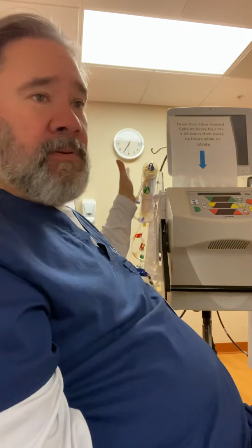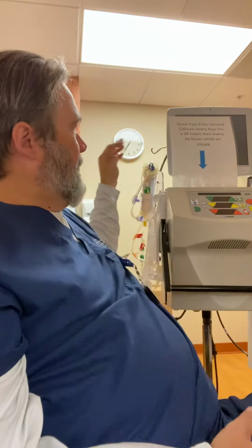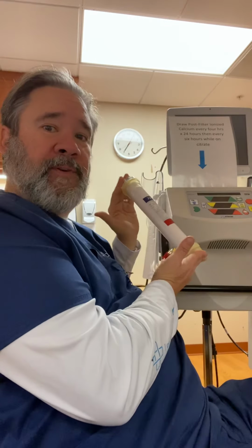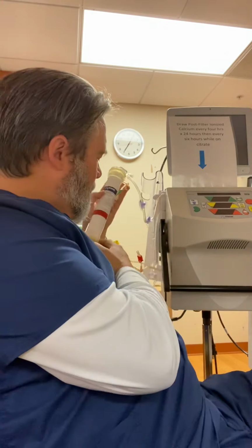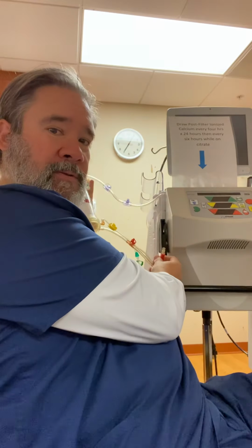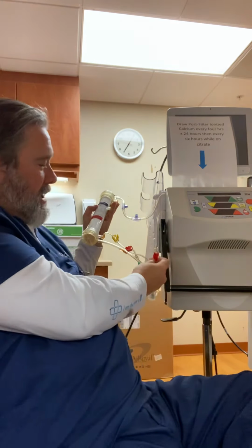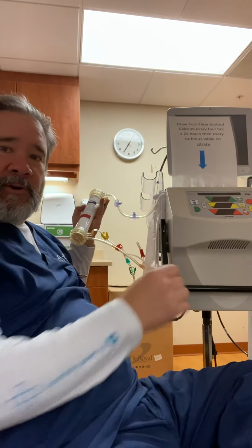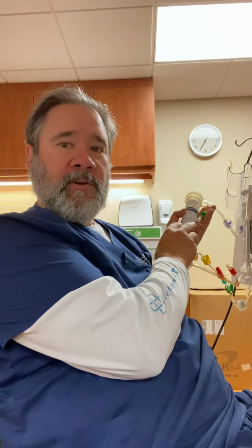We have other options. We can do regional heparin or regional citrate. Regional being, this is our region, right? This is our region, here to here. The filter, that's our region. That's all we're really trying to anticoagulate. So for heparin, it would just go in through the red access port right before the filter, because it doesn't need to mix with the blood for it to be effective for very long. So it'll coat this filter and give you some protection.